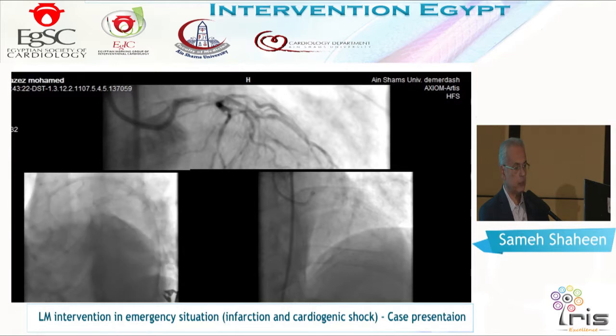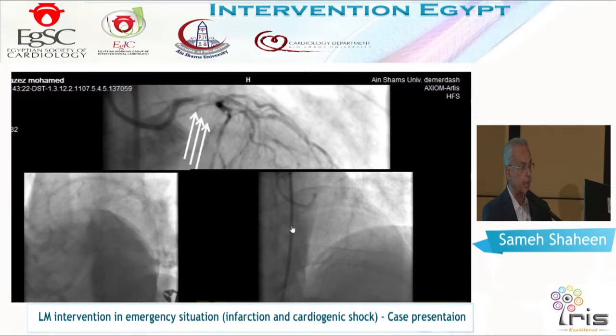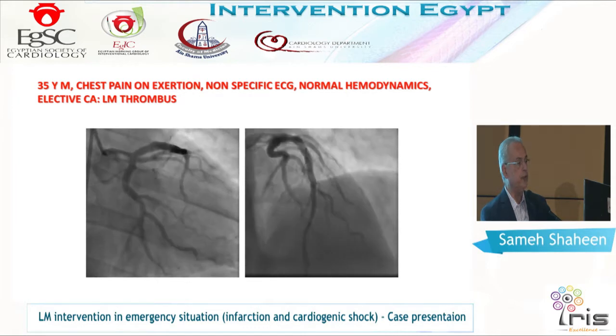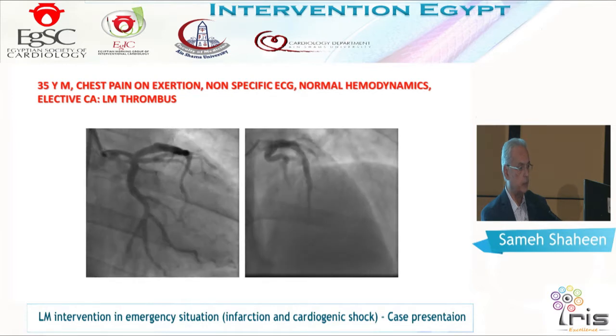But I think that if you concentrate on this view, again, this is the diagnostic view, before the start, you can see, again, this is the LAD when it was still occluded. You can see the haziness present before starting the procedure. And perhaps this might again explain why the blood pressure was still not optimal.